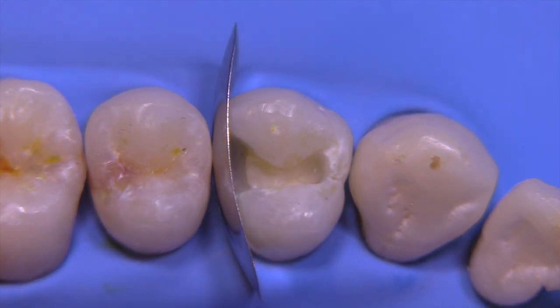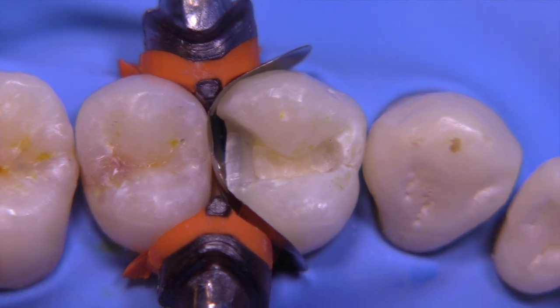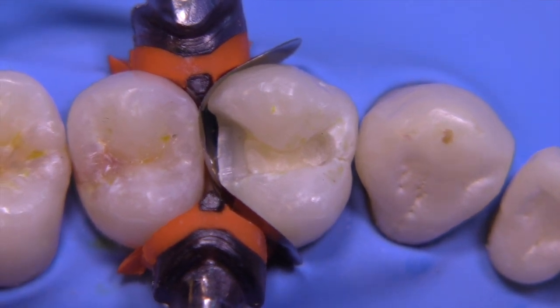This is a contoured matrix band made by Garrison. We're going to use the G-ring from the same company on top of a wedge. I like using a wooden wedge — I feel that they compress better and create a better seal than the plastic wedges.